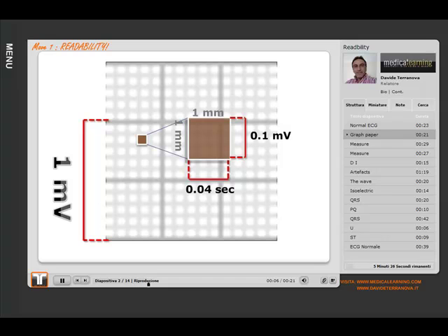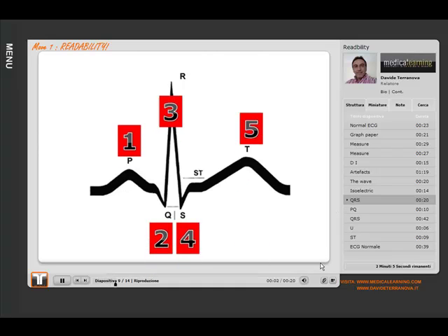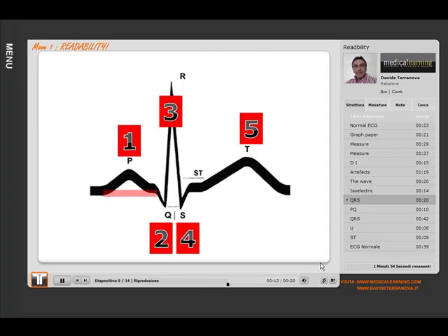The first wave is called P wave and reflects the atrium's electrical activity. Usually such wave is positive, it goes upwards. Between the P wave and the Q wave there is a segment, usually horizontal, said PQ.